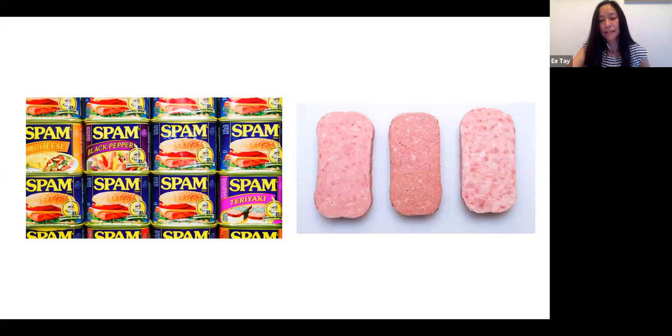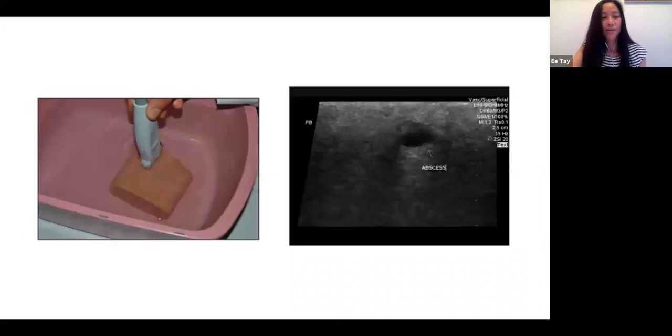And if you actually put some sort of a vascular type simulation in there, then if you do a venopuncture and then you withdraw your needle, it actually self-seals. So you can't really see the needle tracks. I know it's pretty creative here.